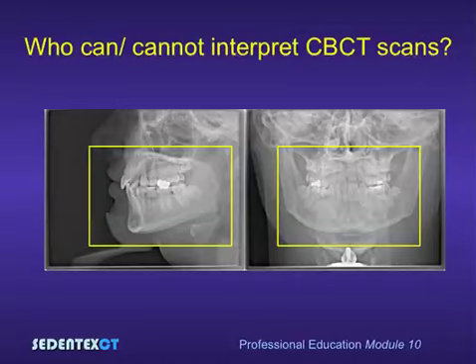There is a lot of logic to this approach. In this area, dentists are reasonably familiar with interpretation of two-dimensional radiographs. As such, it is certainly feasible that training can be achieved to allow them to be competent in interpreting three-dimensional images. Clearly, outside this volume, dentists are not currently adequately trained to interpret two-dimensional images, so the interpretation of three-dimensional images would be very challenging indeed.